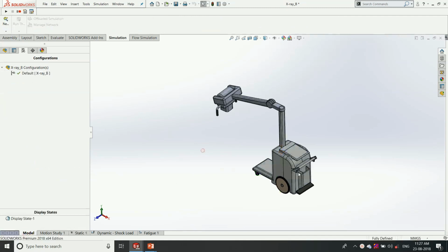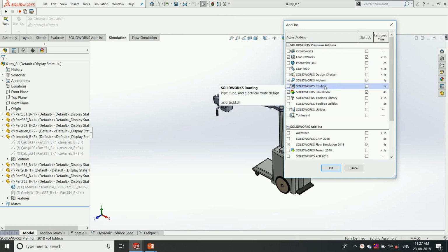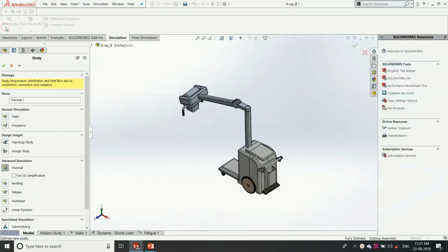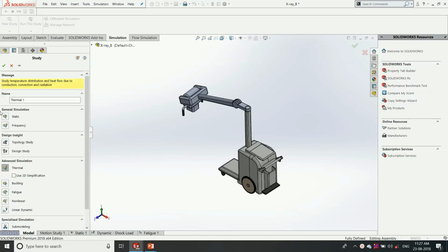So this is the model window. From here I can choose the add-in option, where we can choose SOLIDWORKS Simulation. So by choosing this add-in option we will get a separate Simulation tab. From here we can choose a new study, where the list of studies is available. So now we are going to choose a static study here.